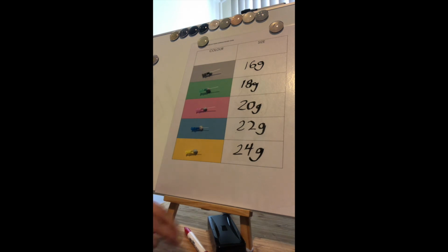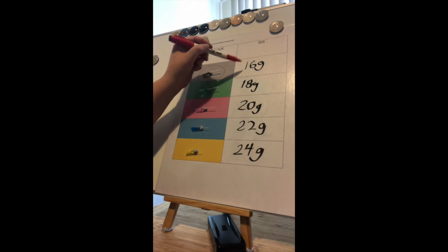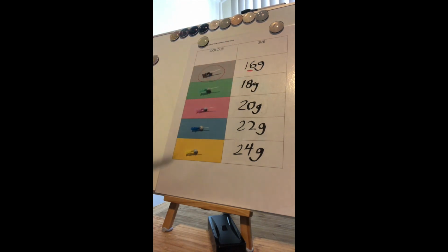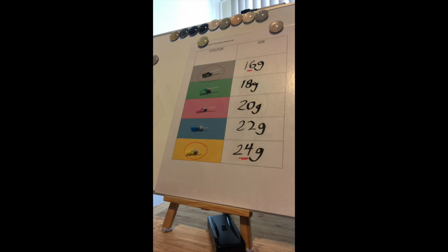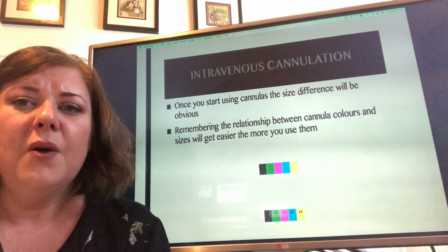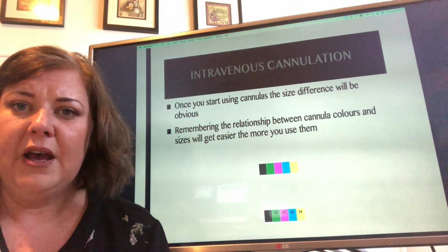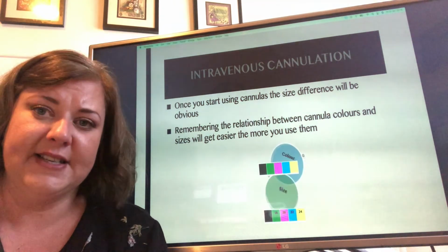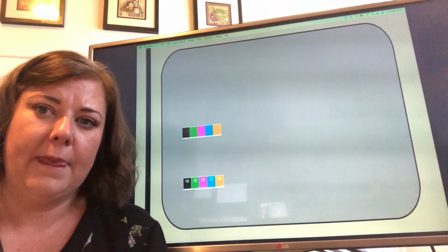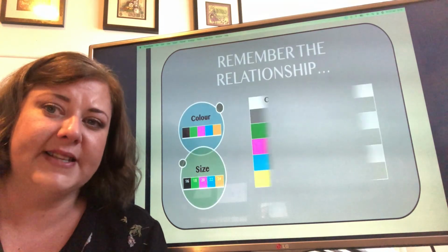Now that that's all together, I hope you can see that our larger size cannula is actually the smallest number, and our tiniest cannula is actually the largest number. Again, once you start using cannulas, you're going to get better at this. It's just really important to try and remember the relationship between colour and size. So we need to remember colour and size.